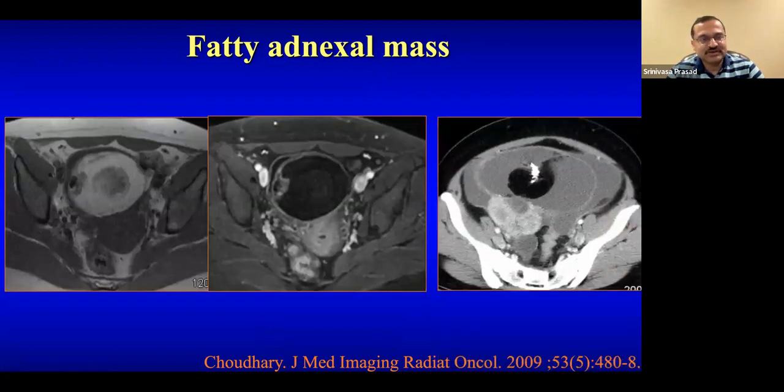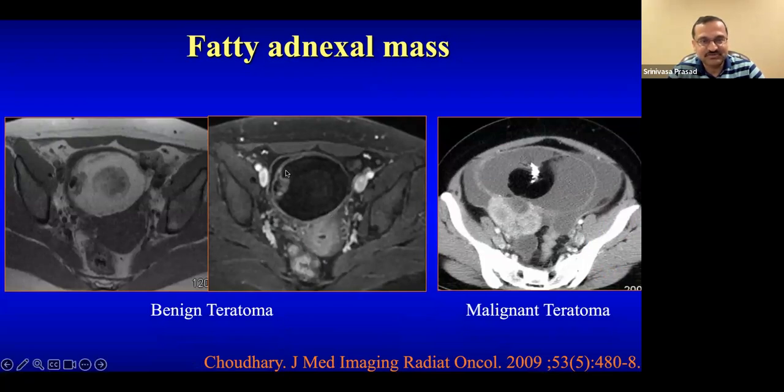So in essence, we need to distinguish between so-called benign teratoma from malignant teratoma. So you could potentially have a macroscopic fat containing mass with some small volume of enhancing soft tissue at the Rokitansky protuberance. So that's the area where there is the marked heterogeneity of calcifications, enhancing soft tissues, fat, or cystic component. They're all admixed.